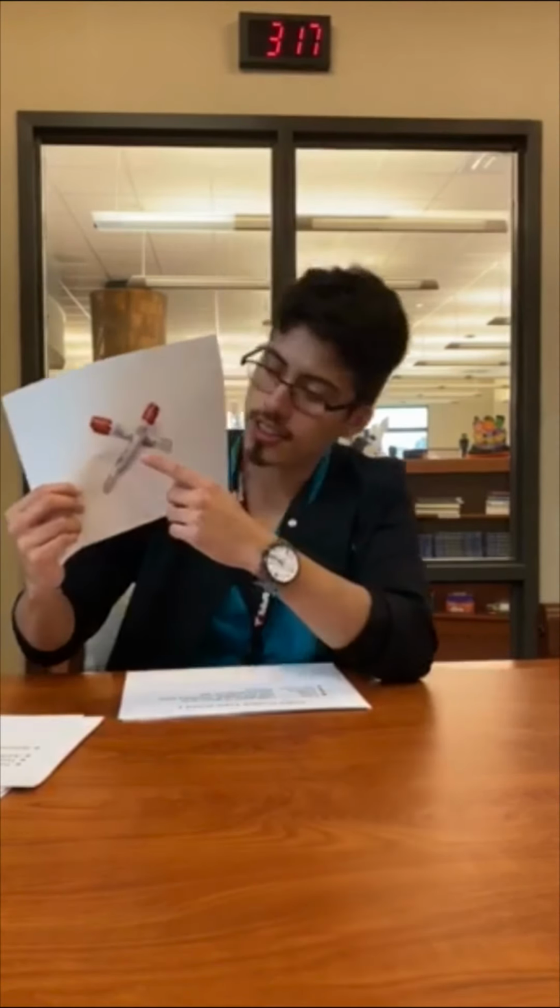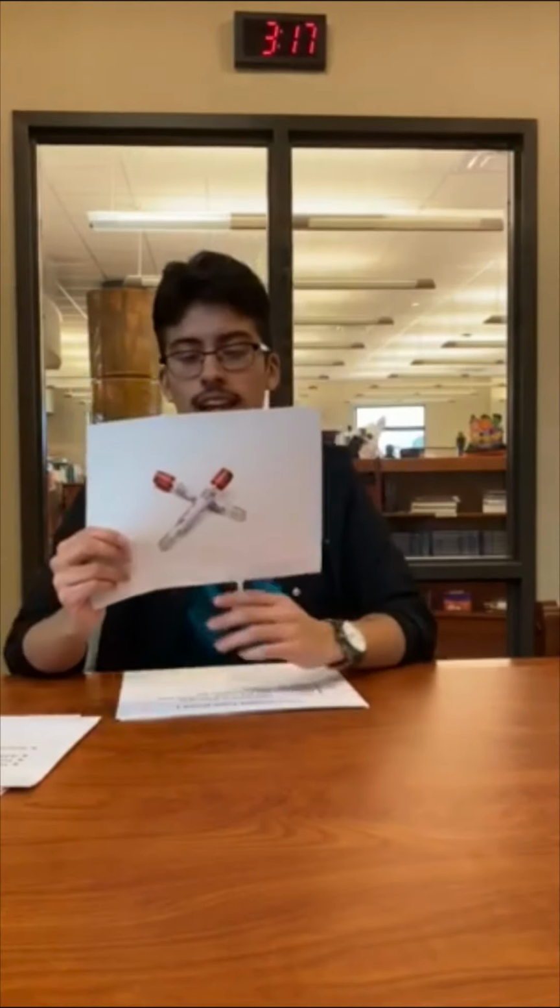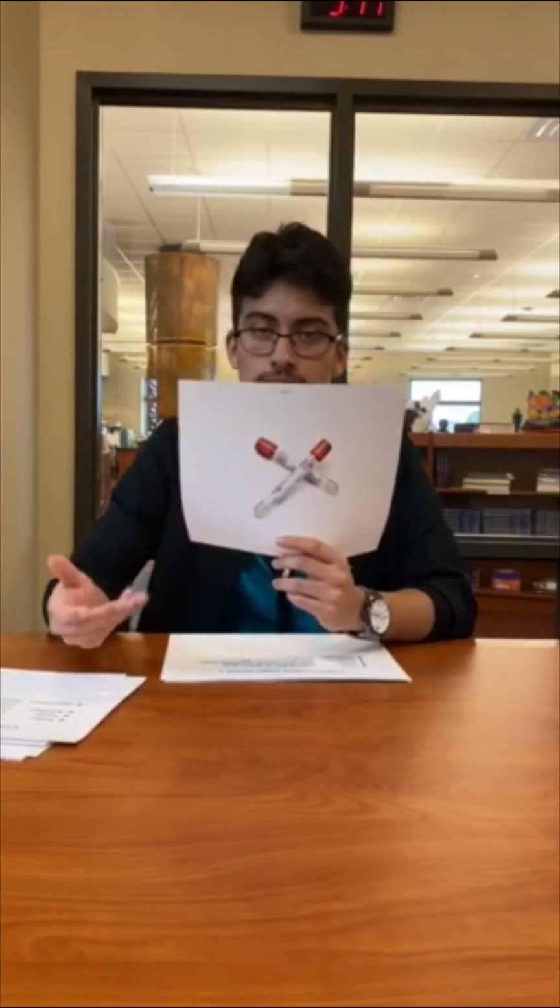And now we have stay. So this is a tiger top, or it can be gold, and it's used in most chemistry tests. It's called a serum separator tube. And its additive is a clot activator with polymer gel, with or without, depending on the test, and its specimen is serum. So this is stoplight red, stay, for serum separator, SST.